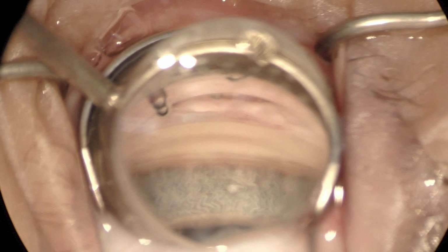It'll dive a little bit posterior, which isn't a terrible thing, but what happens is the inlet that's inside the eye next to the trabecular meshwork will actually face the iris, and that's where you can get some of the iris plugging.